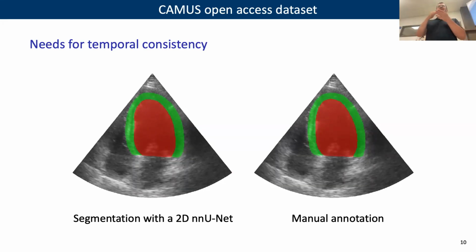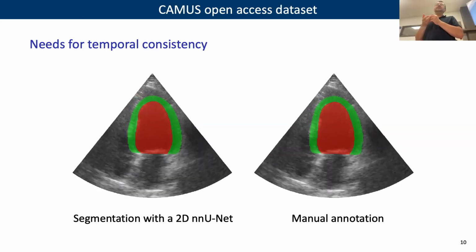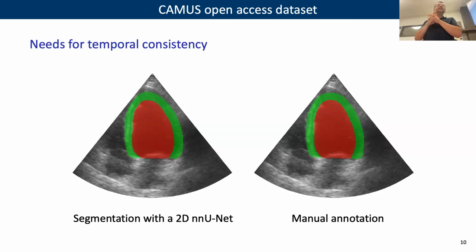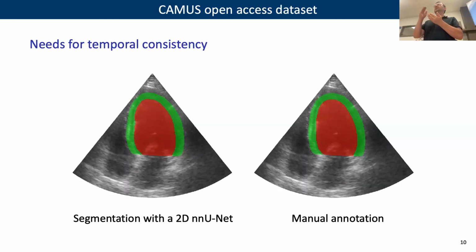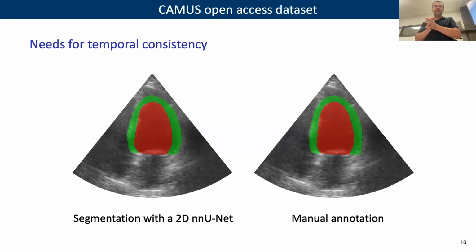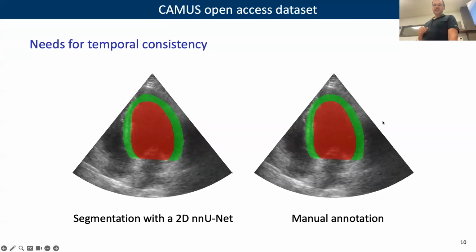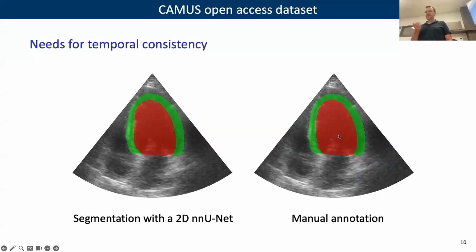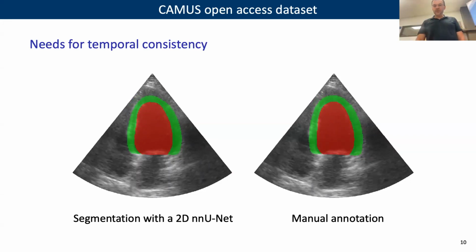The small differences that you can see are nicely explained by the intra-observer variability. The intra-observer variability is the limit that you can expect in terms of precision, but between 2 images you can have small fluctuations because you're inside that intra-observer variability. And the manual annotation on this image is this one. So we want to go from this to this, but we are not so far. So we could imagine creating a scheme that will allow us to correct that.